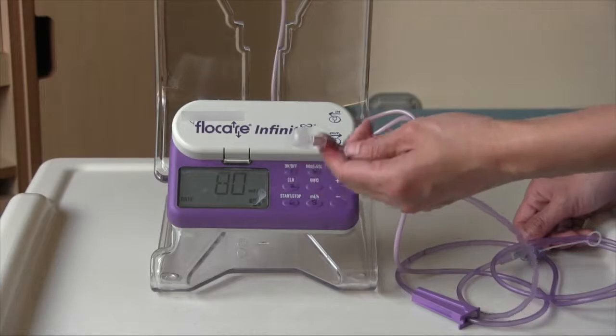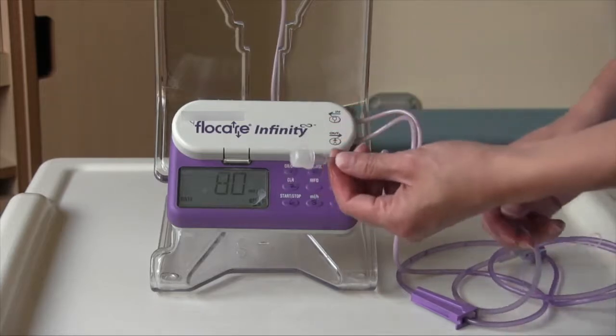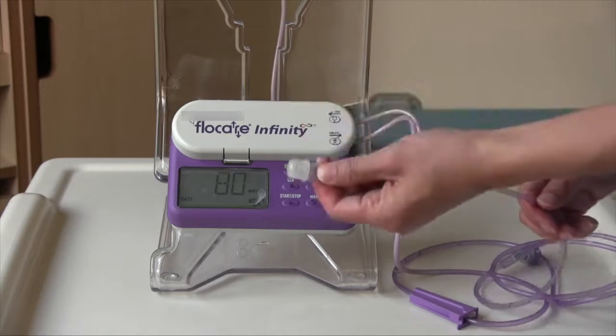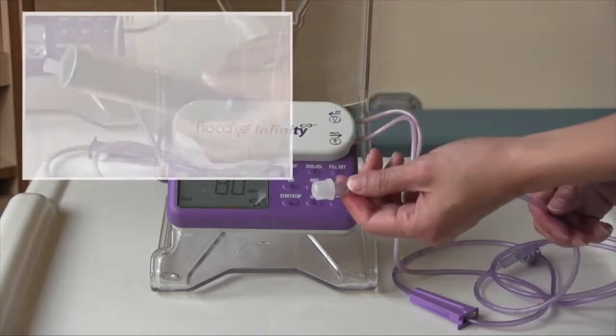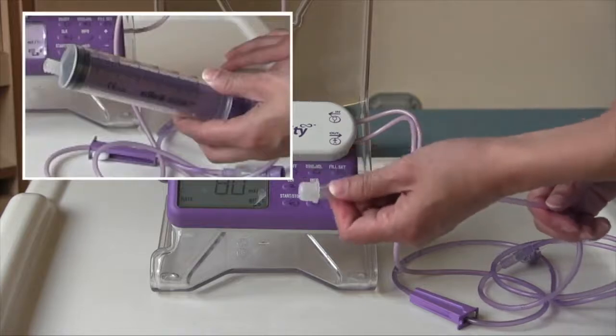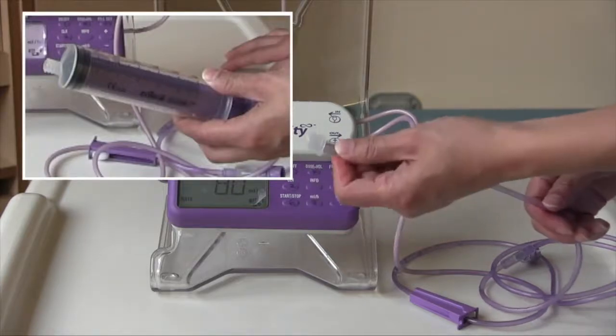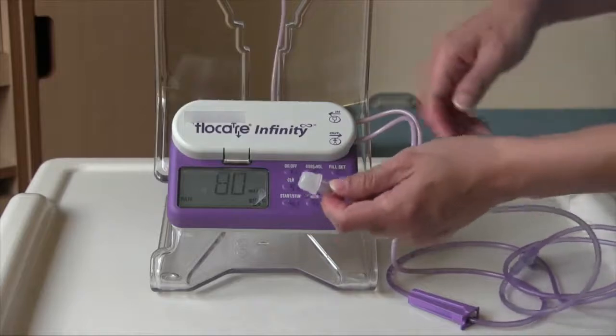Once your giving set has been primed or the air is out of your tube, you can now connect the end to your feeding tube. Before you do this, you'll want to flush your feeding tube with water. It's important to do this to prevent blocking of your tube and to rinse out any previous sediments.